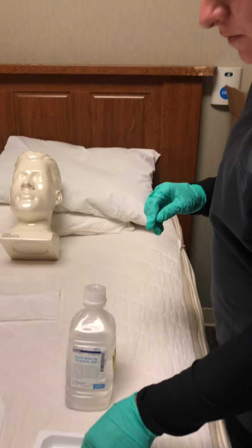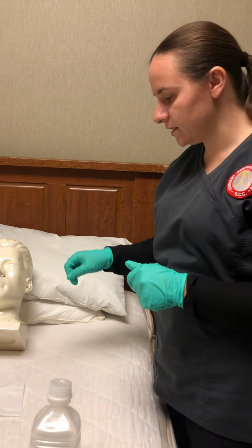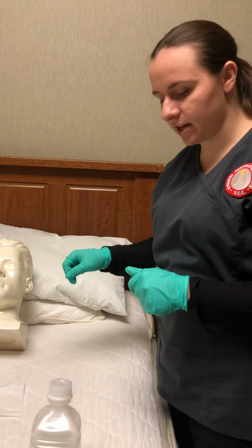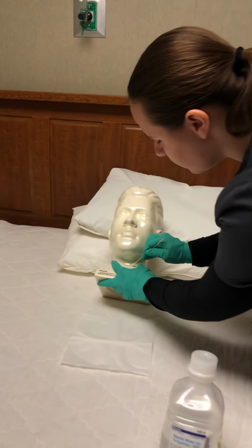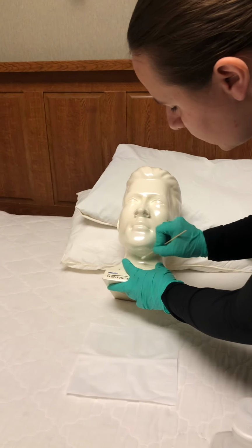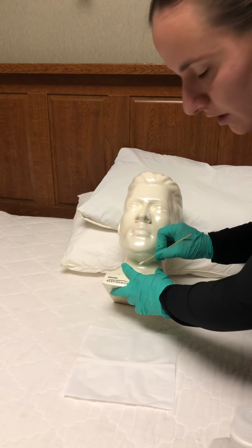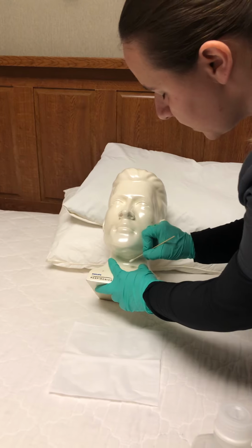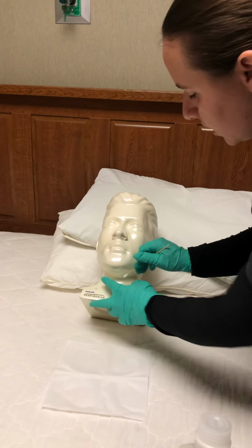And always let it air dry a little bit before you place it back in to the patient. When you're ready, before you place it back in, always hold your stoma, and clean around the stoma underneath. Then clean around it to where you clip it in, because sometimes you can get those secretions on the outside. You want to clean around that and make sure it's nice and clean.